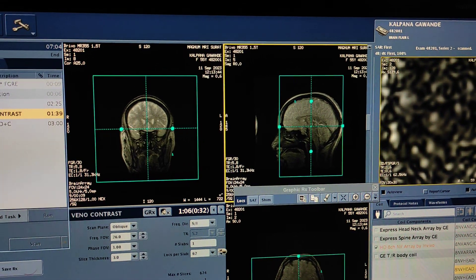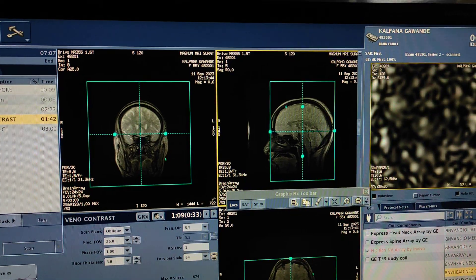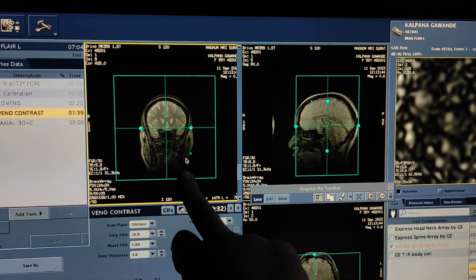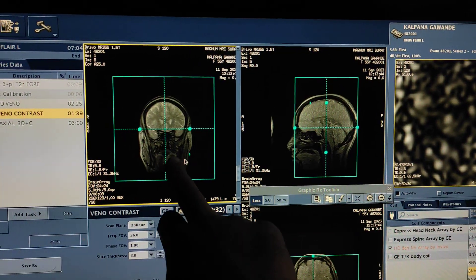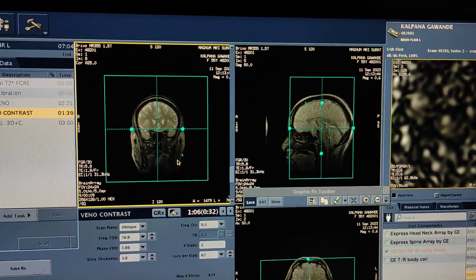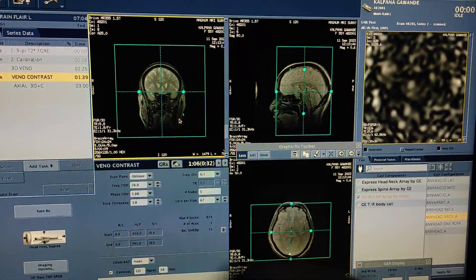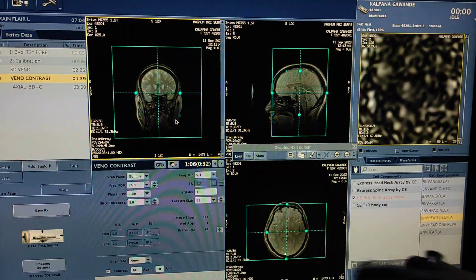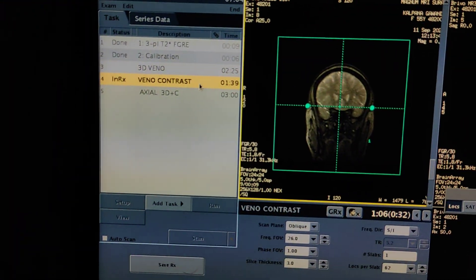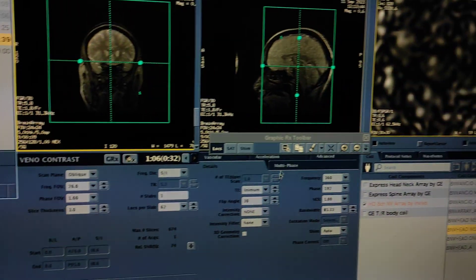Take a few extra images. The orientation of this sequence will be in the coronal plane. Set the box on coronal and plan on axial and sagittal as well. This is the sequence for contrast.